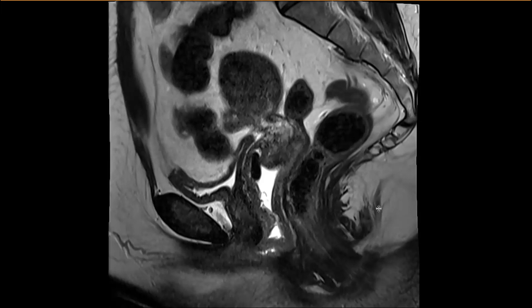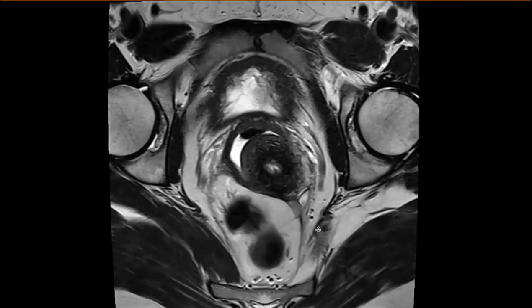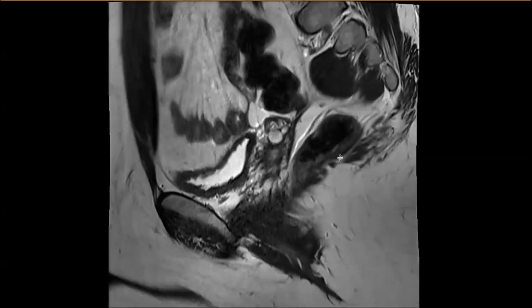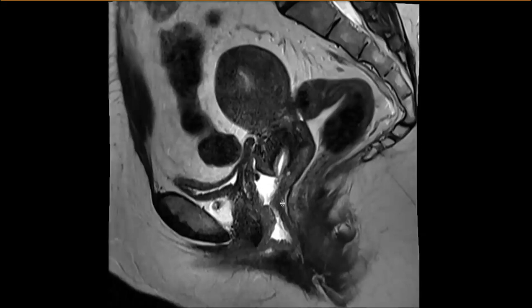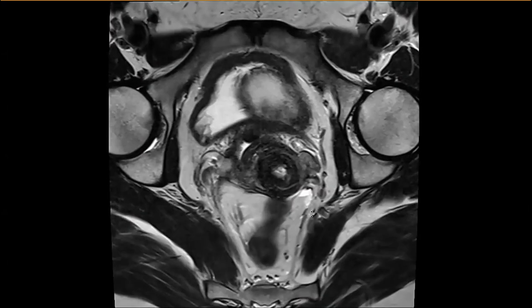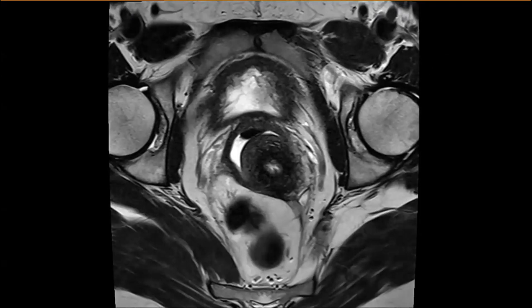In retrospect, the uterosacral ligament thickening could have had other causes — like a prior hemorrhagic cyst that ruptured with some fibrosis. The uterosacral ligament is part of the surgeons' standard search. What's not part of their search is invasion depth, bowel involvement extent, multifocality — those are where MRI adds real value. I'm more focused on structures like the bladder or bowel where MR is needed to guide the surgical approach.